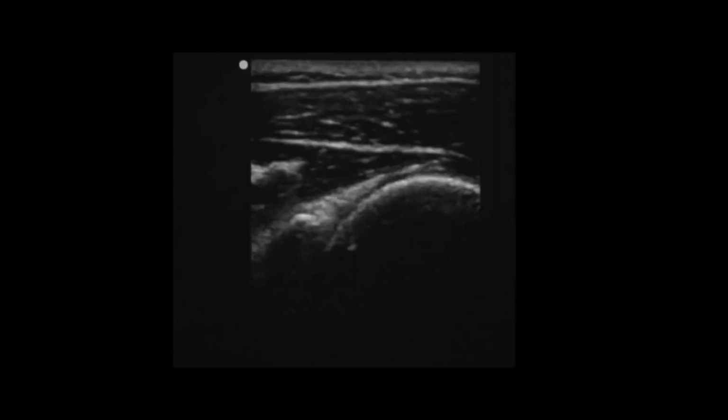When a clean view of the ultrasound is obtained of the shoulder, press the freeze button on the ultrasound screen. This allows the operator to put the probe down because the image is frozen on the screen. You may now drop the calipers by clicking the caliper button. Obtain a tangent line along the humeral head and along the glenoid.